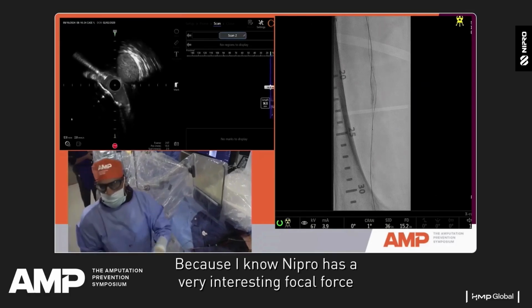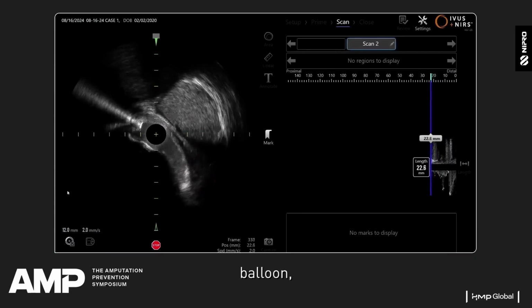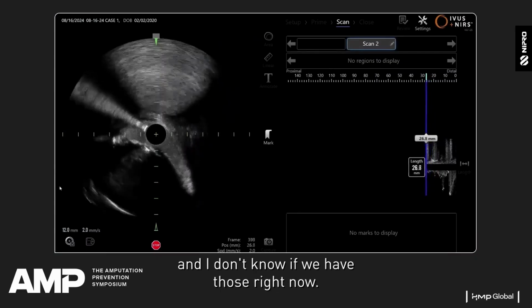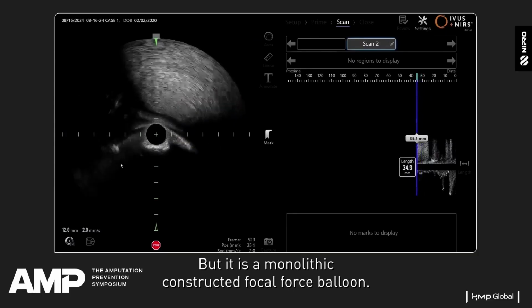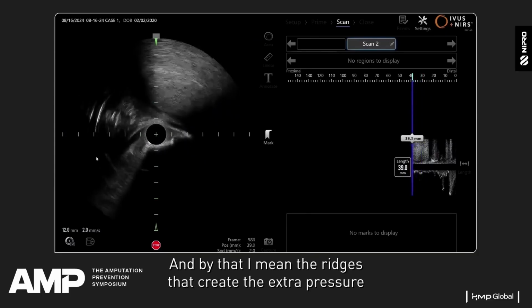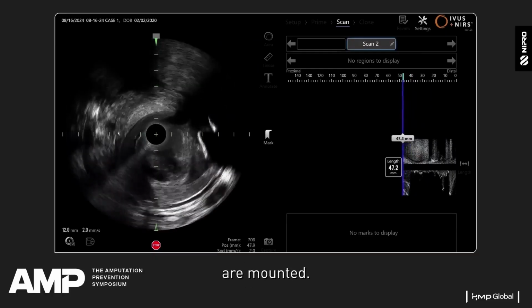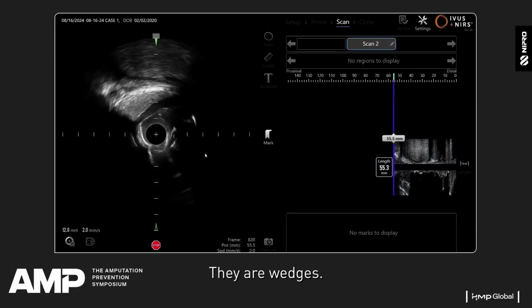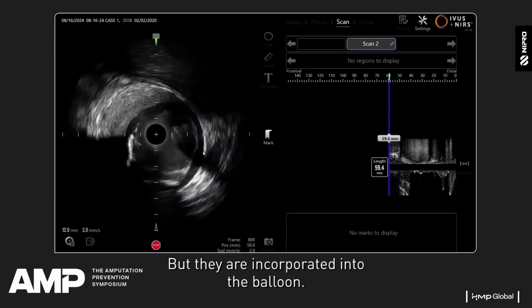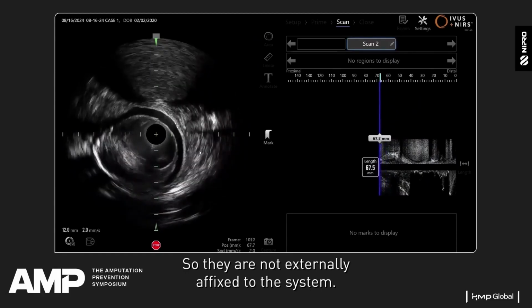Because I know Nipro has a very interesting focal force balloon, and I don't know if we have those right now, but it is a monolithic constructed focal force balloon. By that I mean the ridges that create the extra pressure, there are 4 of them, are mounted at 90 degrees apart from each other. They're wedges, but they're incorporated into the balloon. They're part of the balloon. So they're not externally affixed to the system.